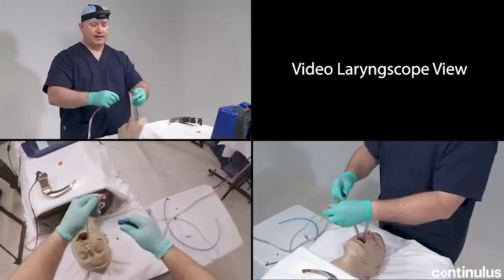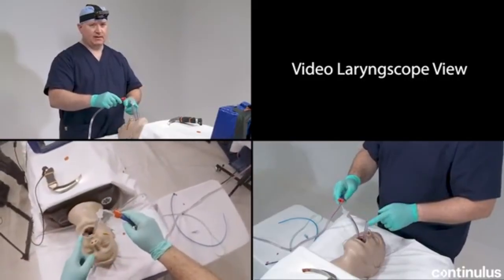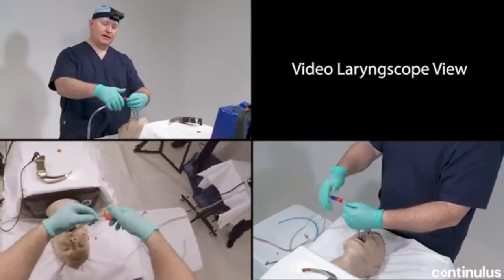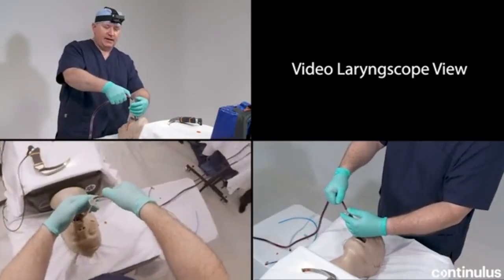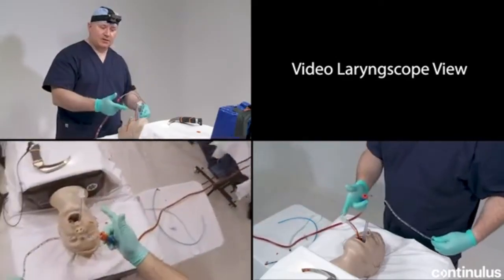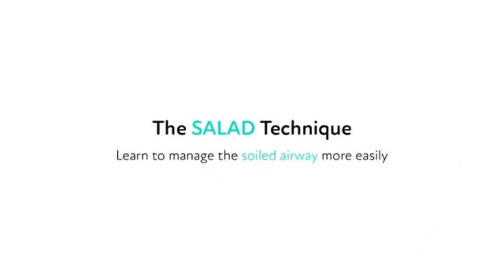Why did I do that? I'm not assuming I'm going to have a lot of help when I do this, and if I disconnect this prematurely, gravity for some reason increases its force during airway management and everything ends up on the ground. If I do it this way, I don't lose anything. And I place my finger over this and I drain the lungs and I draw this out of the patient. And now I can ventilate my patient, inflate my cuff, the whole bit. I should have inflated the cuff before that, but I'm not going to do that in this demonstration.